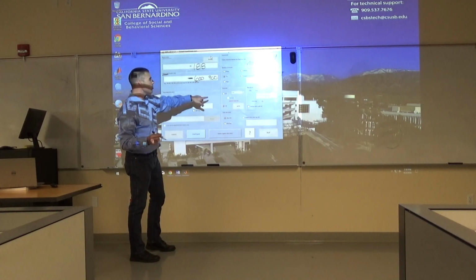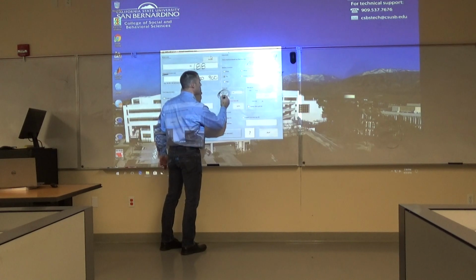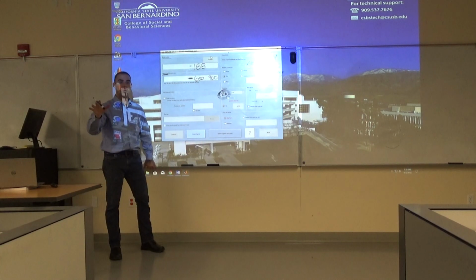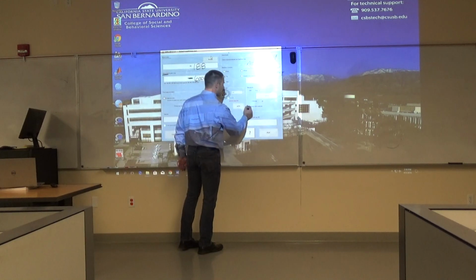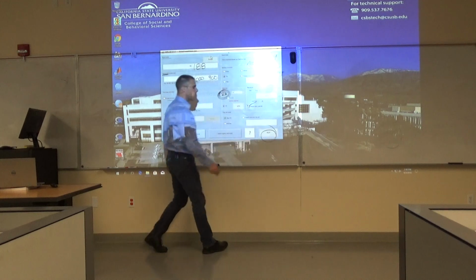Okay, now what you're going to do is select this option here for the map being 2D. So we're going to do that flat map first. Okie doke. All right, and for fun, you can check this box here to display the color bar, and then you're going to hit this box for plot.